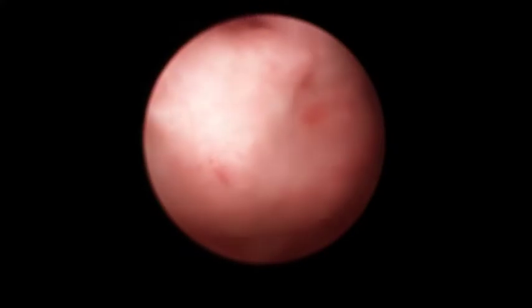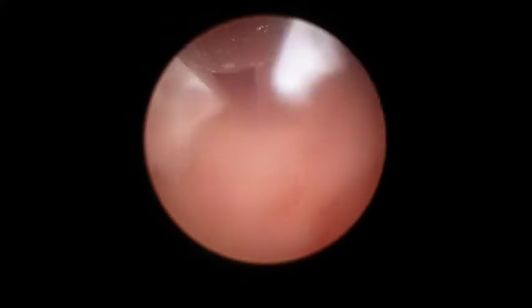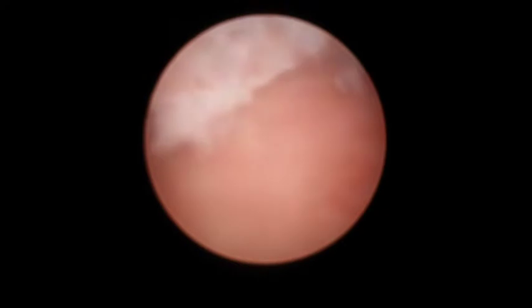The hysteroscopic intrauterine tissue removal device is positioned and resection of the anterior fibroid is started. The device uses normal saline as a distension medium due to its many advantages over high viscosity medium. The main disadvantage to using normal saline is that the blood is not immiscible. In contrast, high viscosity distending media allows blood to appear to drip as the blood is immiscible in such media.